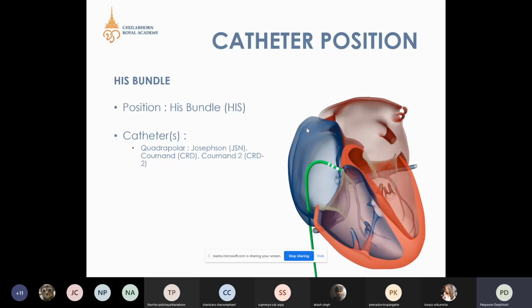Again, if the doctor needs a more discrete and detailed His electrogram or signal at that area, definitely the 2 millimeter spacing will be another choice.